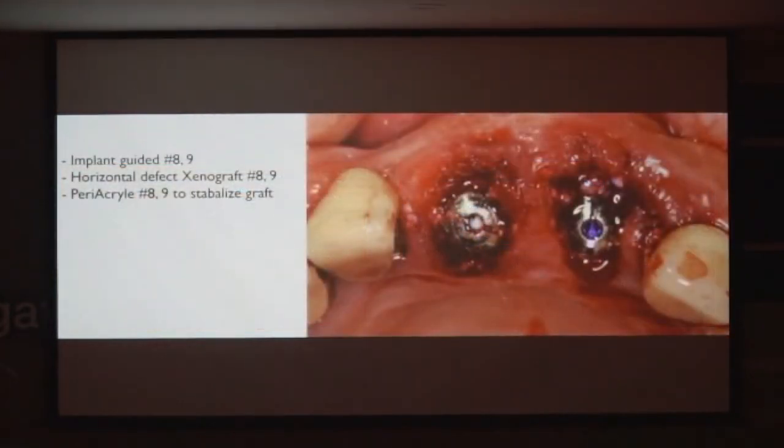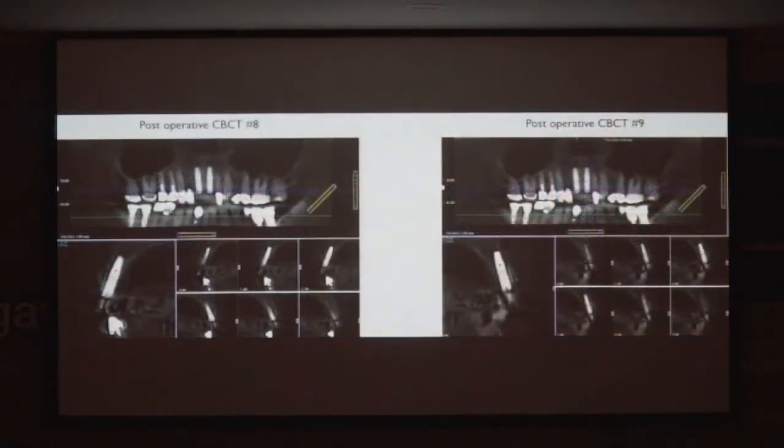And there are the implants with the bone graft. And the tissue's angry looking, but it was angry to start with. So here are the implants. This is the post-op x-ray, and it's a little hard to see, but I actually measured out how much of the root I left behind.